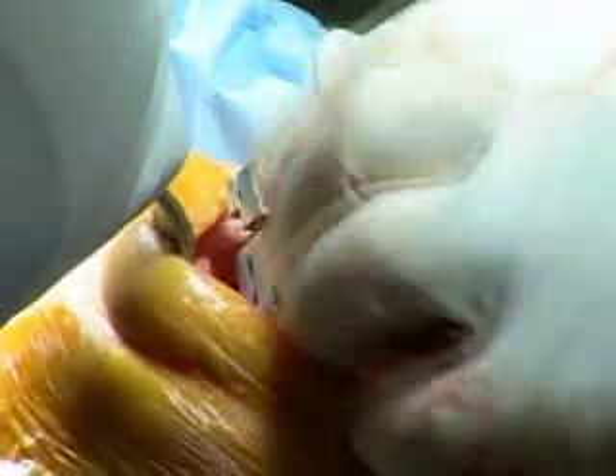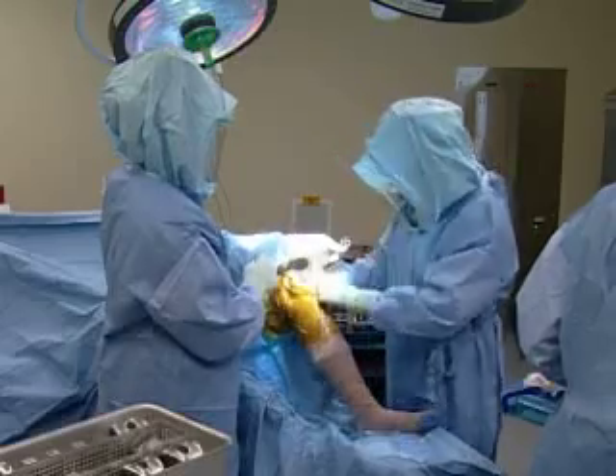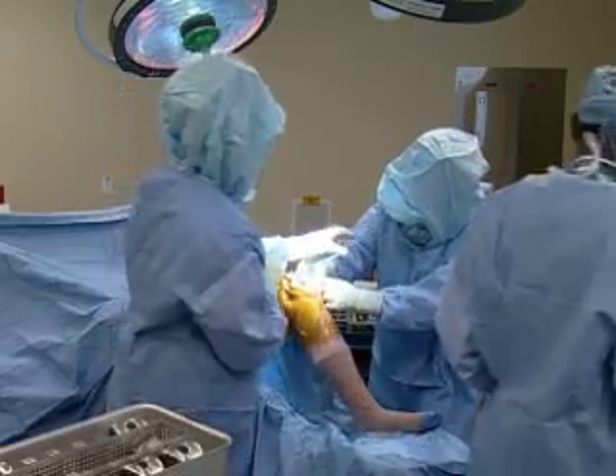You're taken off the surface of the joint in vanilla wafer-sized cuts of bone that are replaced with a new surface — a new smooth surface — to get rid of their knee pain.